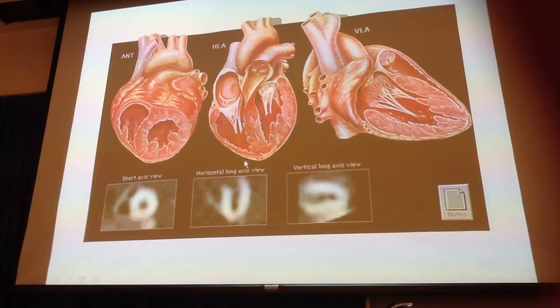What was the question? Whether or not it's viable. Yeah, this is the question. Okay, you have a patient that comes in. Does perfusion tell you if the myocardial tissue is viable? No, it doesn't. It just shows you how much blood is going to that area there.